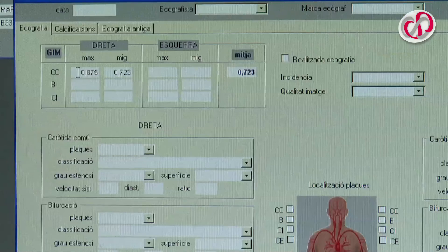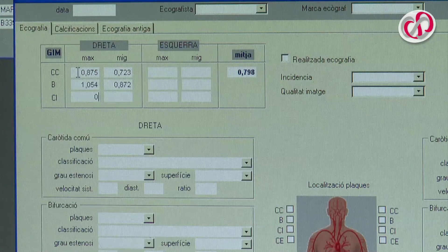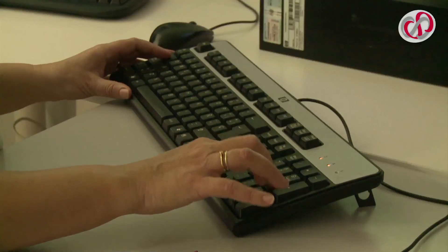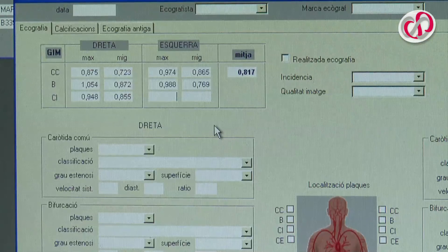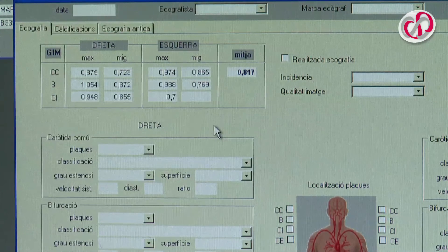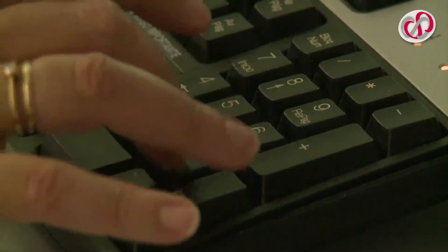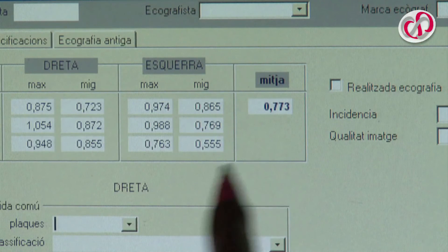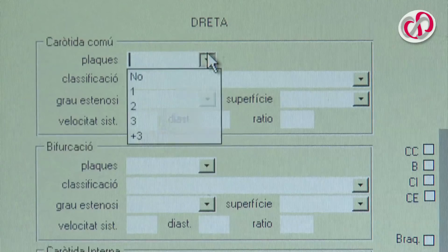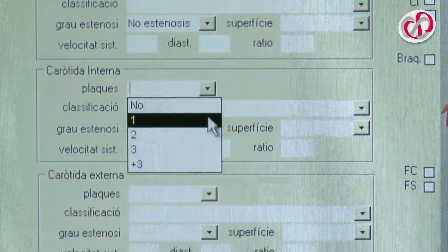Step 4: Introduce the data in the registry sheet. Record the maximum and average value of each of the segments studied on the left and right carotid arteries. The value indicated on the screen is the patient's intima media thickness, corresponding to the average of all values obtained. Register the presence or absence of atheromatous plaques and whether plaques cause a hemodynamically significant stenosis in any of the segments studied.